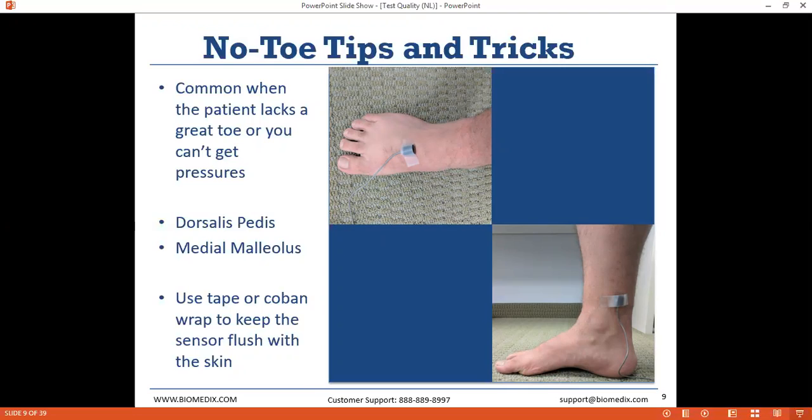The first location in the foot where you can detect a pulse is called the dorsalis pedis. To find that, moving down from the ankle along the arch or the top of the patient's foot, if you simply drag your fingers lightly, you can often find that artery by moving your fingers lightly over the patient's skin. I personally often find it fairly challenging to detect that location. So the other location is the one that I typically use in these situations.